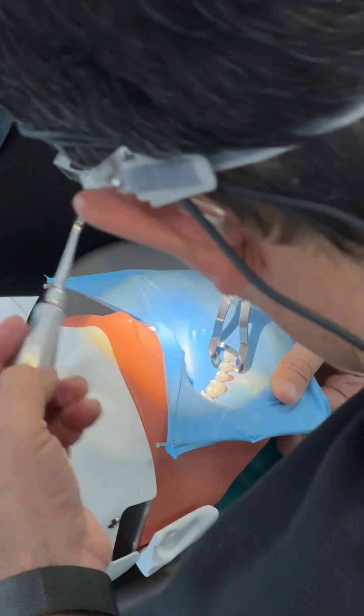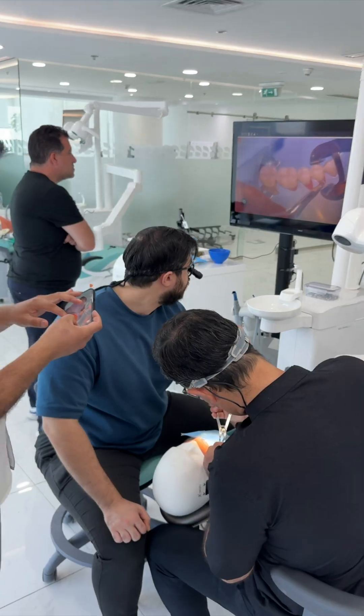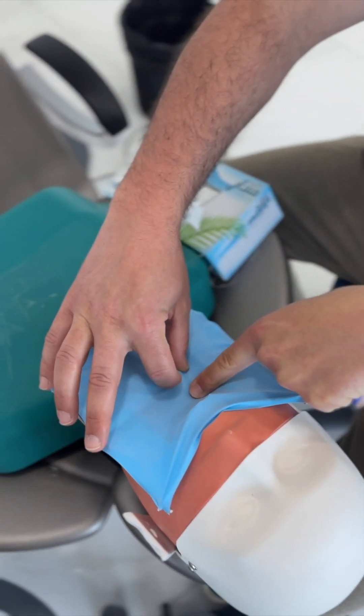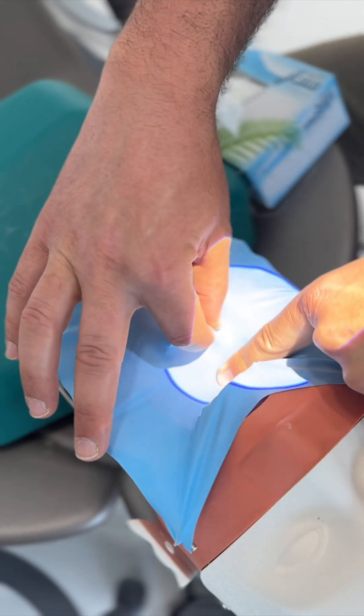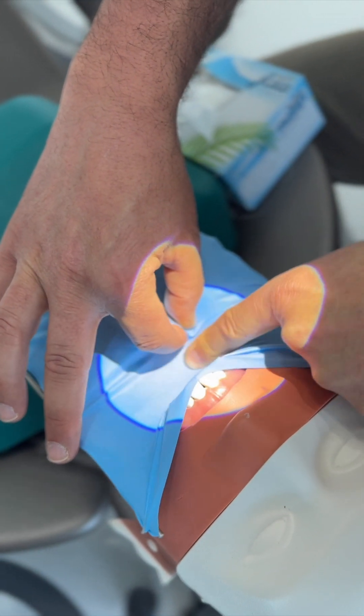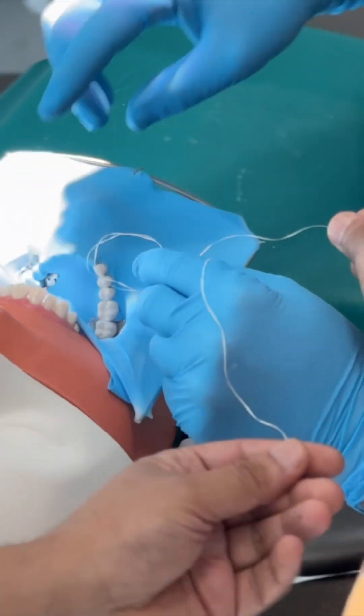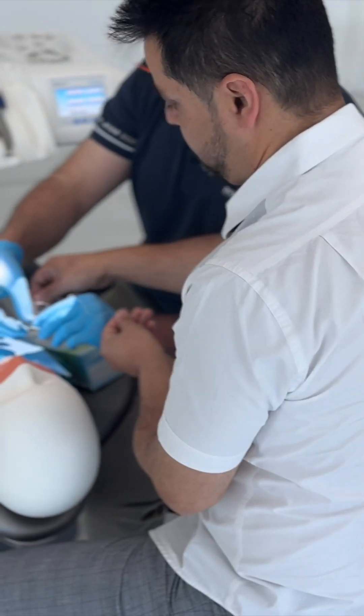Now I'm just gently retracting, and I'm using the instrument with my left hand, then I push. You have to put your finger in the middle at the beginning. It's not too much strength — that's okay. The position of you, just a second, you have to be here.